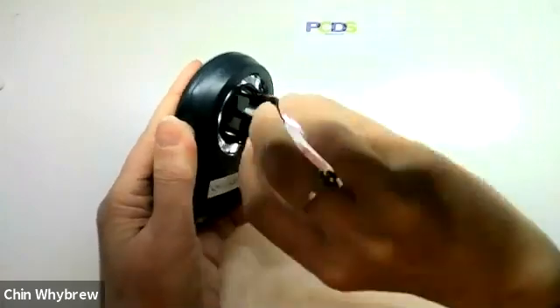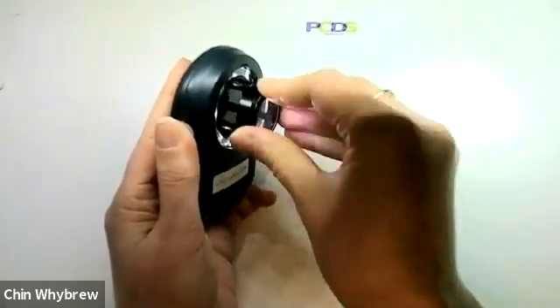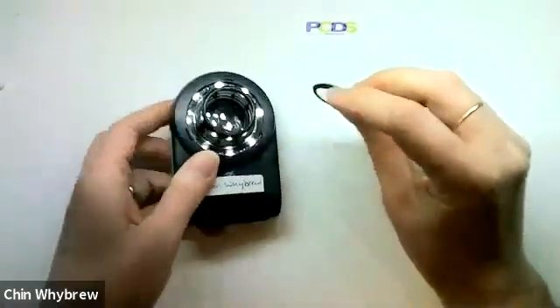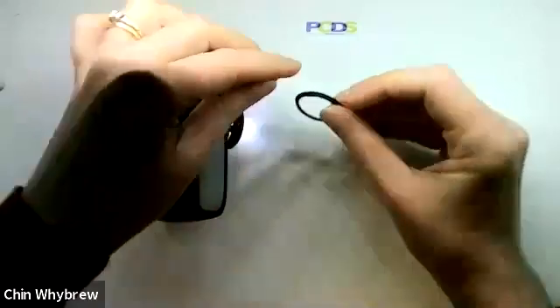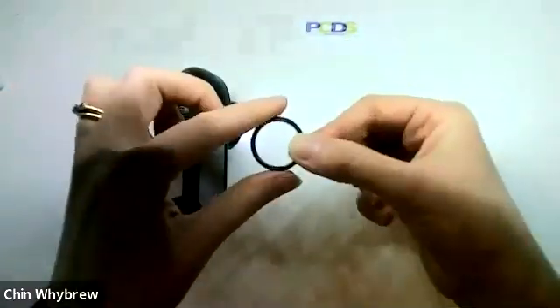And the other thing you'll find is that whatever gel you use as your contact fluid will tend to get stuck in this thread. As you can see here, I've got some stuck in the thread and that makes it sticky and difficult to get off.